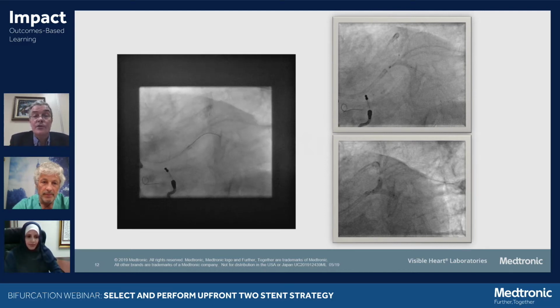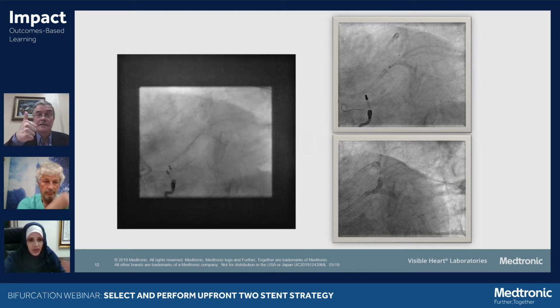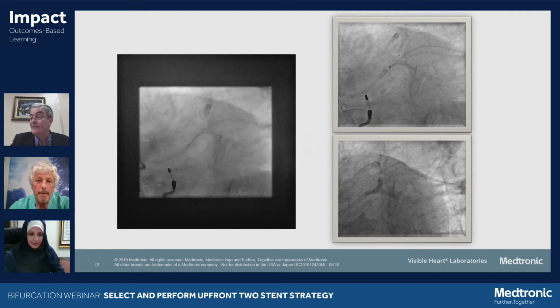So you did crush with the bigger balloon, or you use the same balloon, higher pressure with the proximal position? No, whatever I would normally POT with is what we usually take to crush. So you use two balloons according to appropriate suggestion from the European Bifurcation Club. Excellent. Please continue now. For now, I think we have clear answers to all the questions that we got so far.